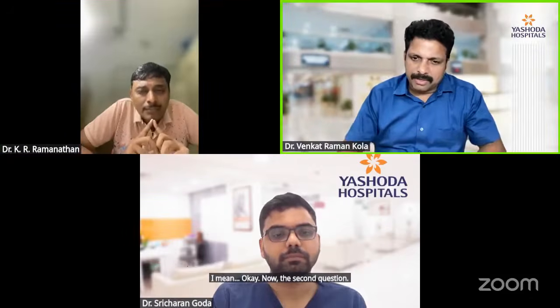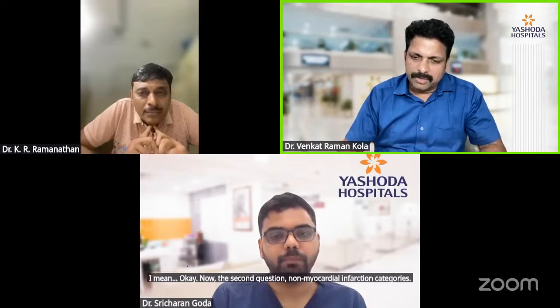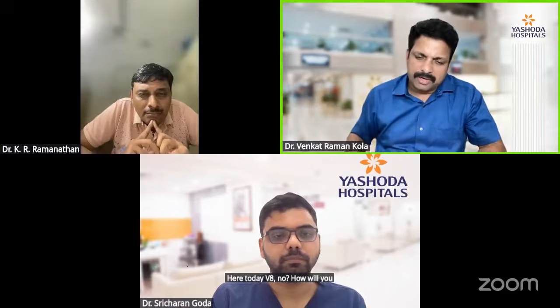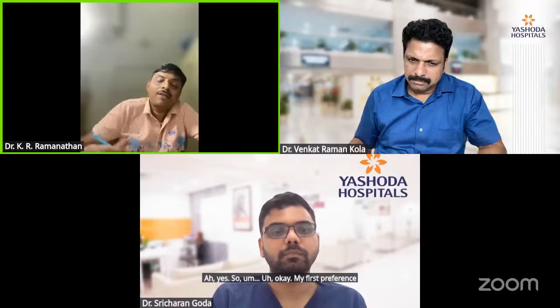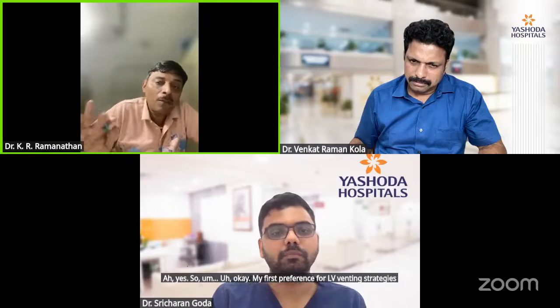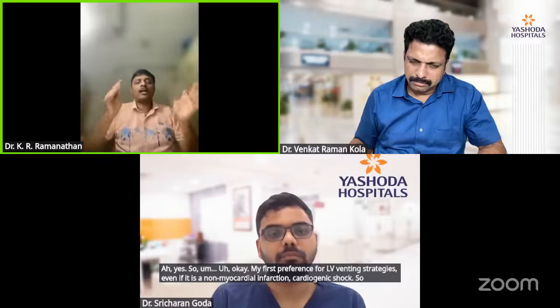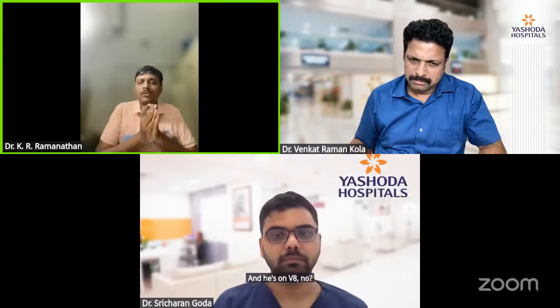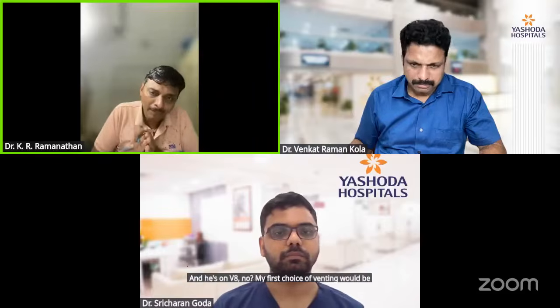Okay. Now the second question: in non-myocardial infarction categories, where a VA ECMO is initiated, how will you choose your LV venting strategy? Yes. My first preference for LV venting, even if it is non-myocardial infarction cardiogenic shock, so even if this patient has myocarditis and is on VA ECMO, my first choice of venting would be IABP.